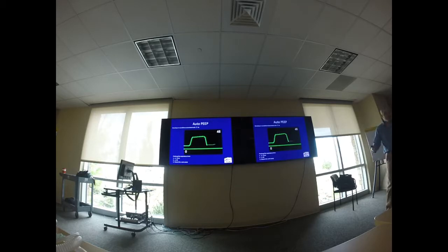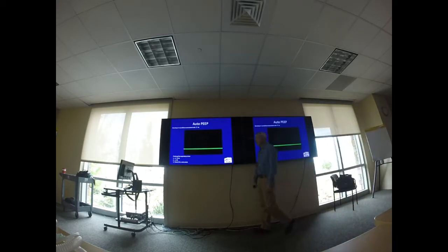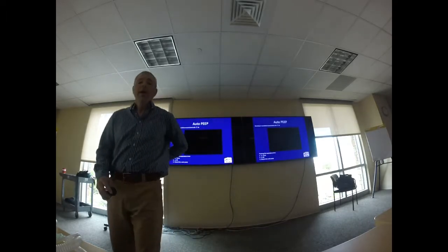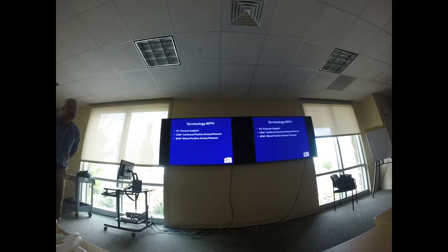I might take him off the ventilator and allow him to breathe out to decrease that intrathoracic pressure. I do all of these things, decrease my I time, decrease my respiratory rate. And I would acknowledge the fact that I had auto PEEP based upon that capnogram.